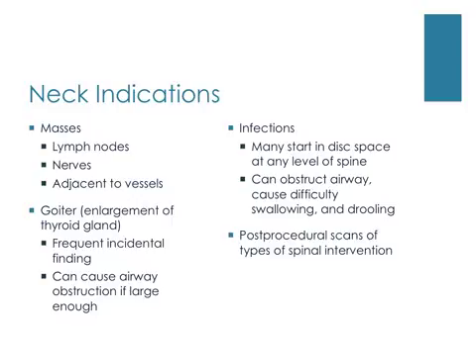Infections are another clinical indication for the neck. This may start in the disc space at any level of the spine, and they can spread to the epidural space, causing an epidural abscess, which can result in spinal cord compression and paralysis, which is very serious, as you know. The infections can obstruct the airway or cause difficulty swallowing and drooling. Post-procedural CT scans of the many types of spinal interventions described previously are common to assess results of the procedures.